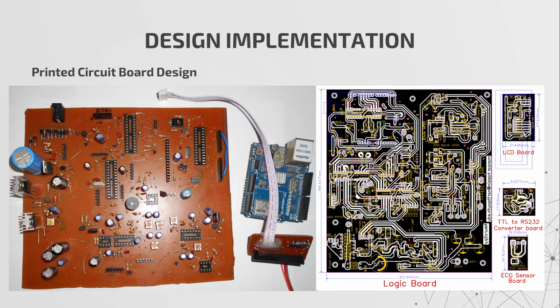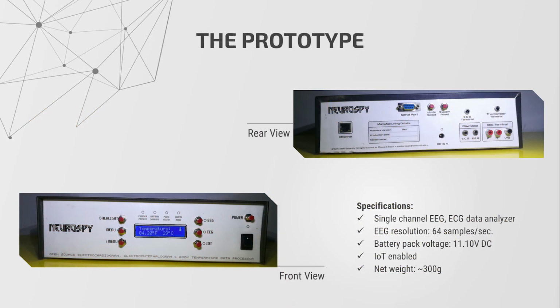Here you will see the main logic board of the system. The physical image is on the left and the CAD representation is on the right. This is our final prototype. It's battery powered, that's why it's completely safe to use with the human body.